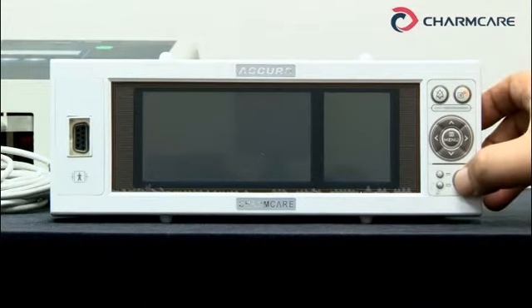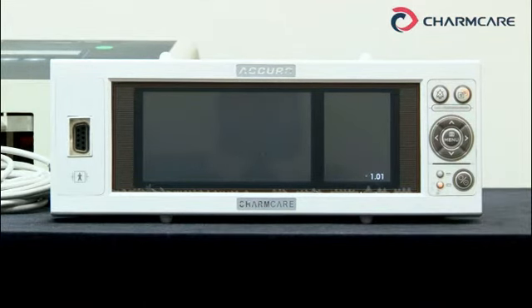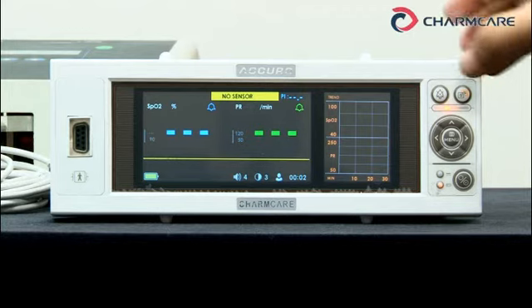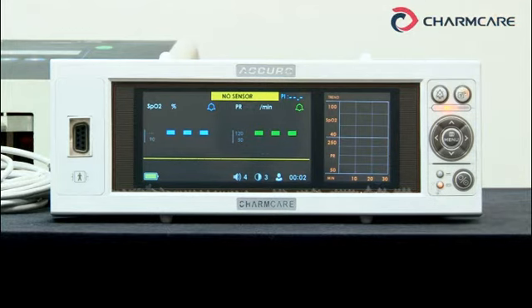This is the power button. Now you hear this sound, but it can be turned off if you press this button. Alarm pause duration is usually 2 minutes, but you can change the duration as you want in the setup menu.